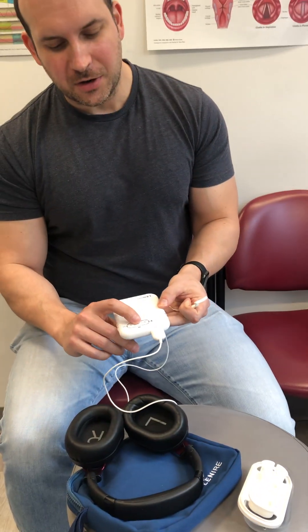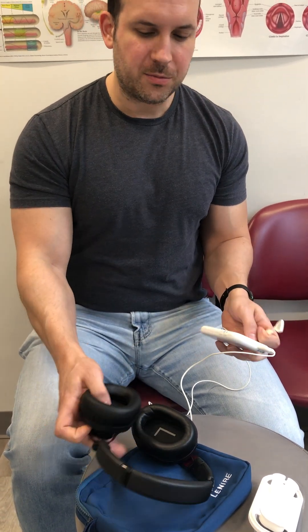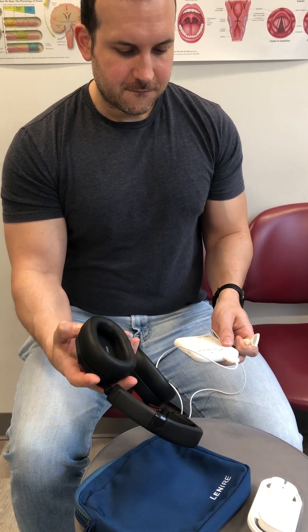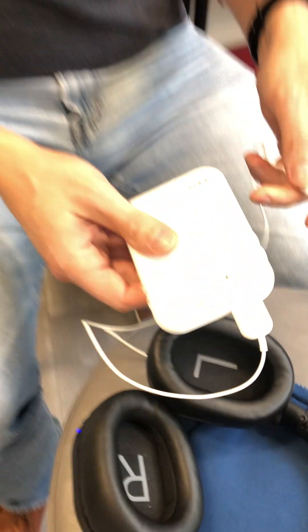You turn it on by holding the power button here, then it goes green. Then you turn the headphones on, and once that's connected it also goes green — that's essentially the startup. Then you put it on your tongue, slightly bite on it, put the headphones on, and hit play.